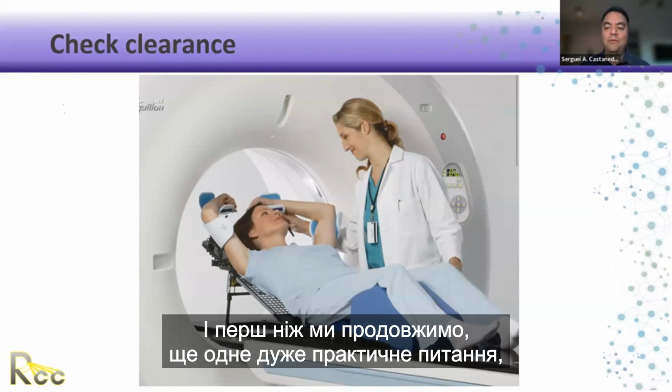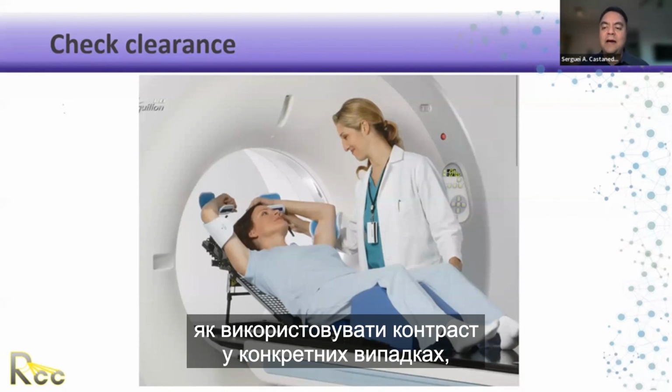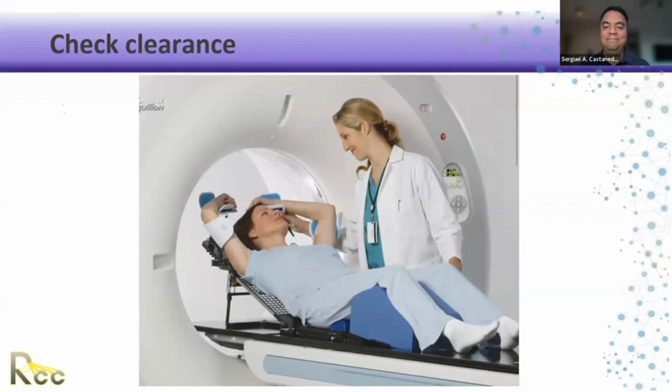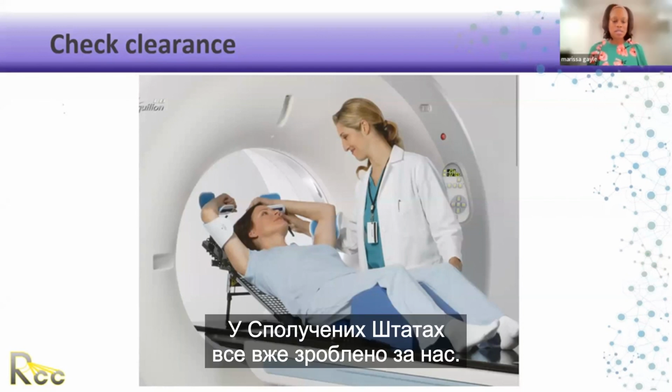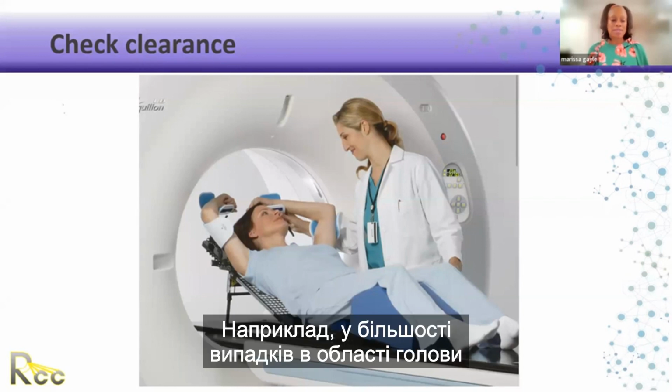another very practical question has to do with whether there are any guidelines on how you may use contrast for specific cases, how much volume, and whether you could share that. In the United States, everything is pre-done for us, so that depends on the doc.